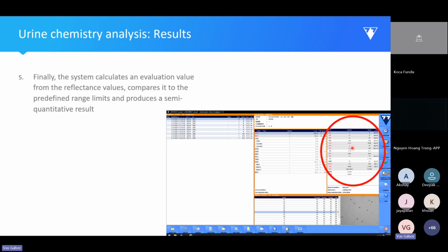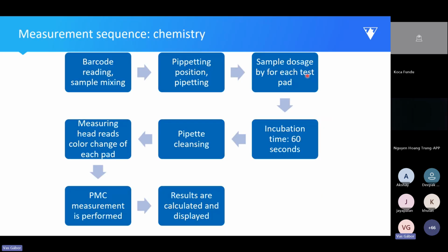So again, just as in previous instruments, the logic is the same. Chemistry results on the right, sediment results on the left. And so this is how it is transparent and easy to interpret.